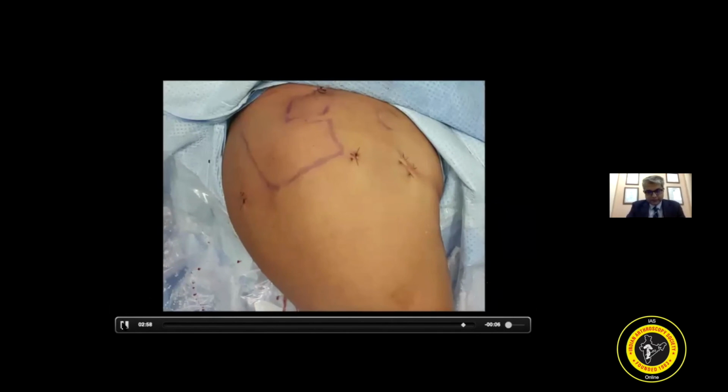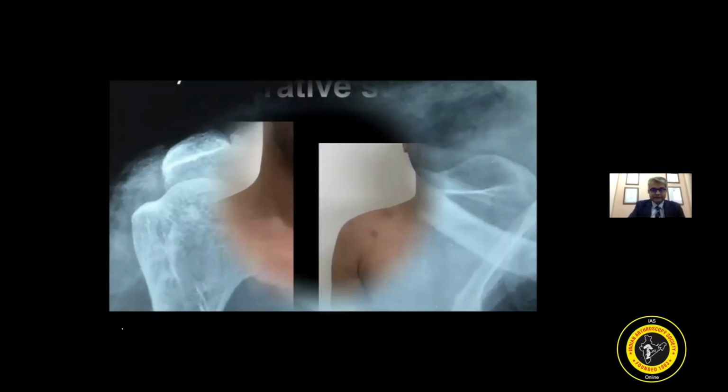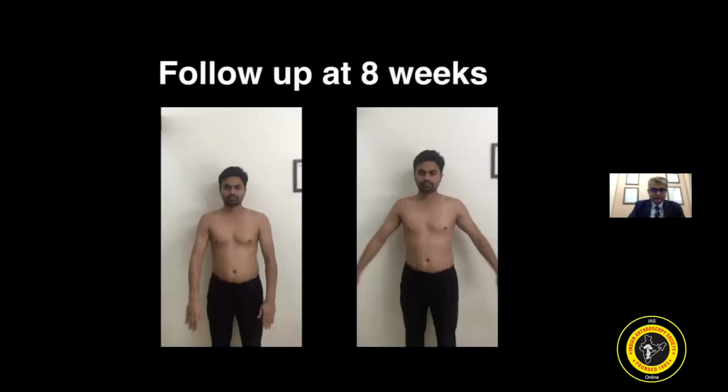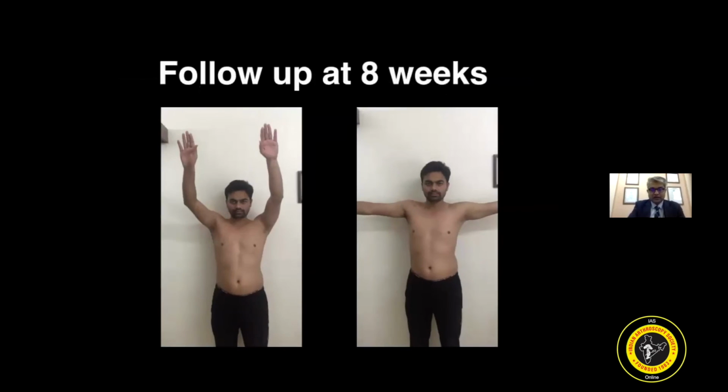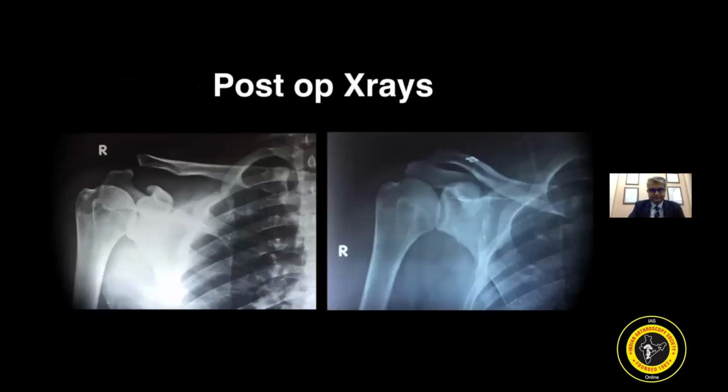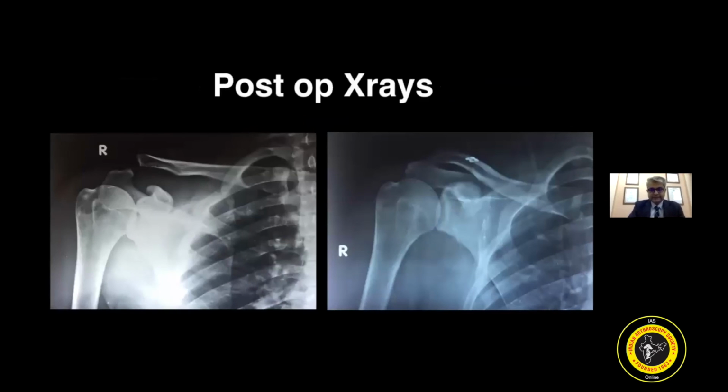The operative scars in these patients are cosmetically appealing without significant morbidity. This is the follow-up of the patient at around 8 weeks, without any pain, without any discomfort. The post-op X-rays show congruent reduction of the acromioclavicular joint with satisfactory position of the two dog bone buttons, one on the undersurface of the coracoid, one on the superior surface of the clavicle.